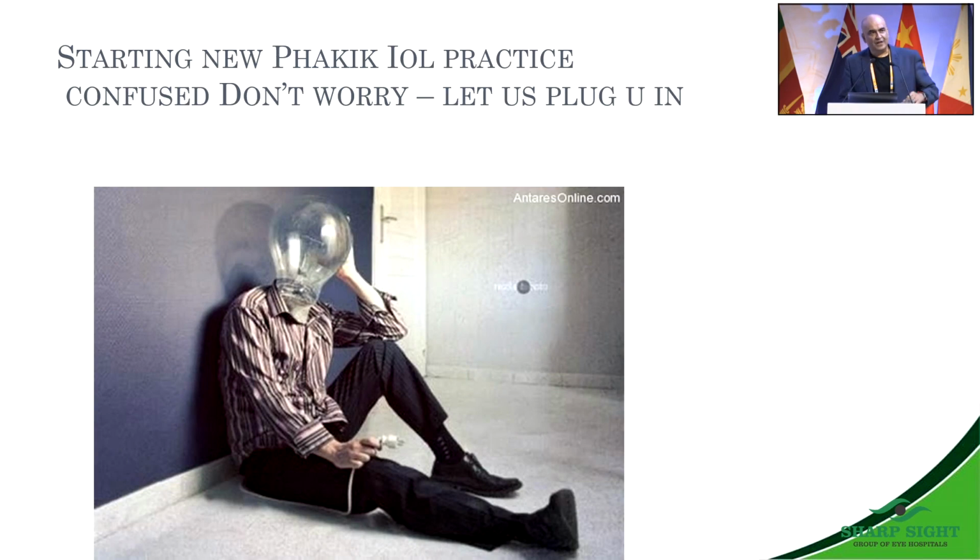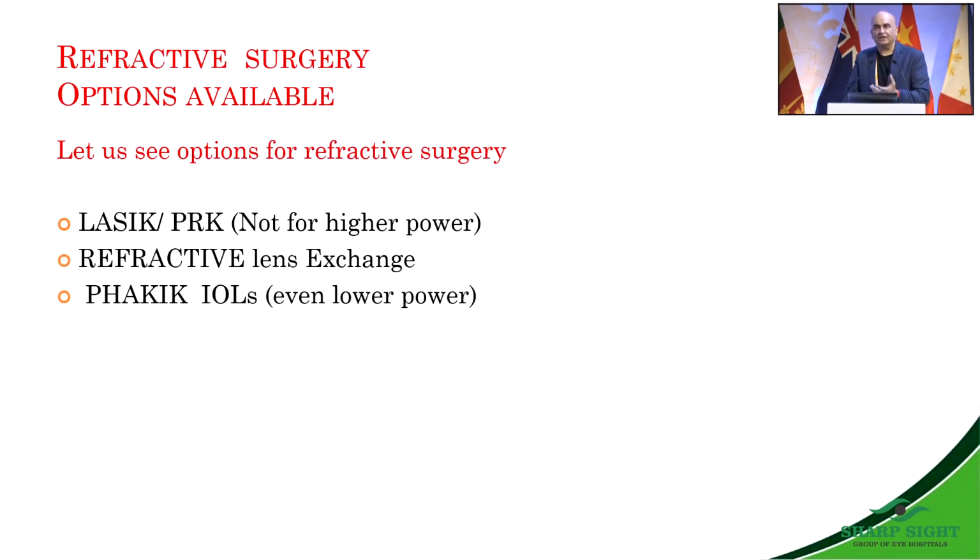Whenever you start a new phakic IOL practice, there is a confusion, there is unsureness. That's all because of lack of familiarity. So let's open our minds to what the basic procedure called phakic IOL is. Let us see what options are available for refractive surgery. Of course, LASIK, PRK, but they are rate limiting. You cannot do them for very high powers. Refractive lens exchange, yes, but it's a little controversial.